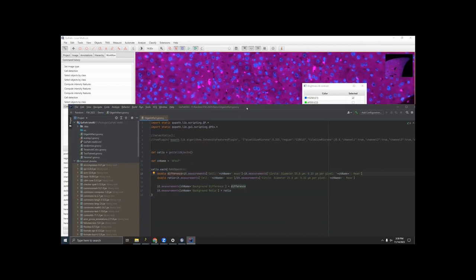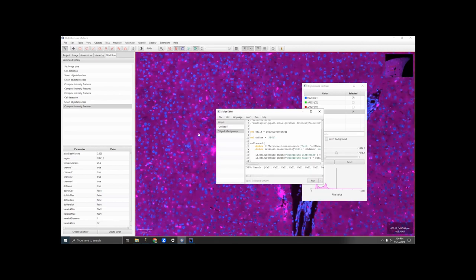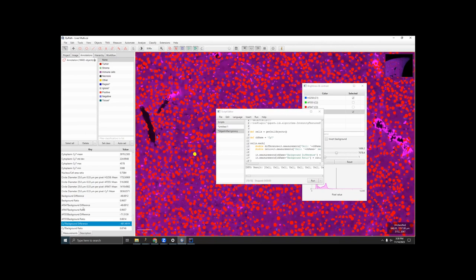Let's save this. Go over here. Again, it automatically updates. And hit run. And now in every cell, we should have, yes, a measurement specifically called AF647 background difference. And in this case, it has the same values as before because it's the same channel. But we can just right here go AF555, button. And now it's got that as well. And Cy7. So now we could easily calculate a threshold for all of the channels just by changing a couple of strings. All right.